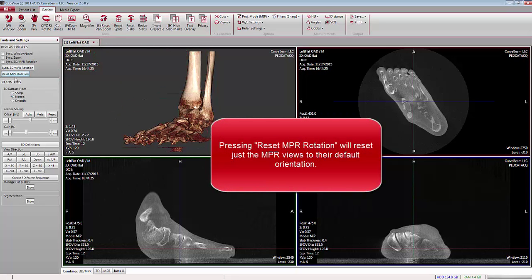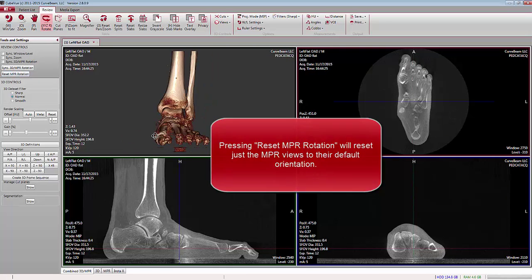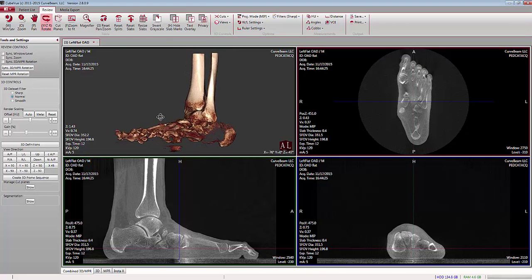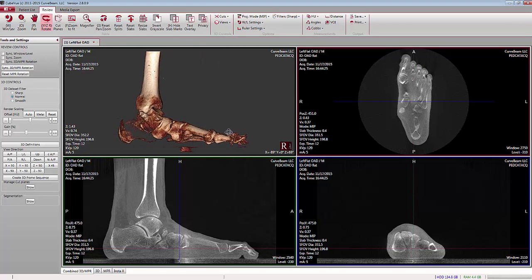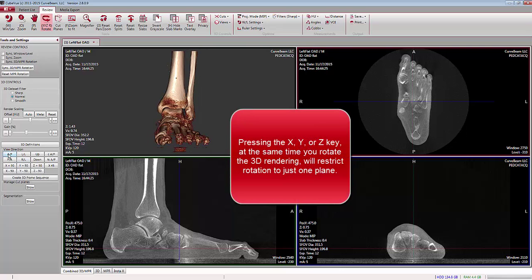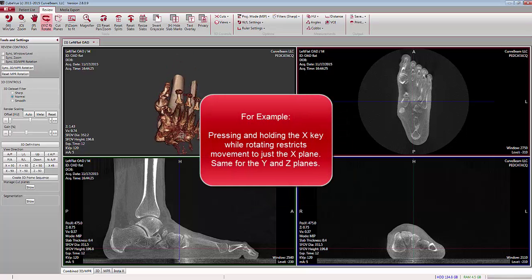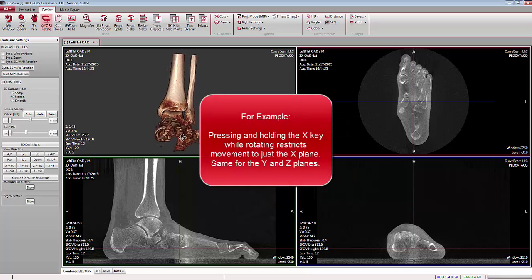You can also reset the MPR views only by clicking on Reset MPR Rotation. If you are rotating the 3D volume and would like to restrict your rotation to just one plane, once you reset, press the X, Y, or Z keys at the same time you're rotating and your motion will be restricted to just one plane. For example, pressing the X key will only allow you to move the toes on the foot up or down.